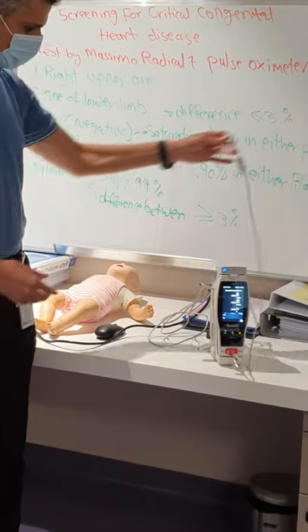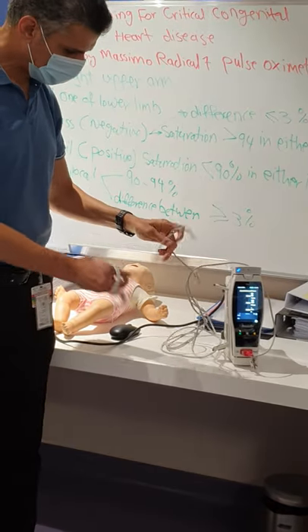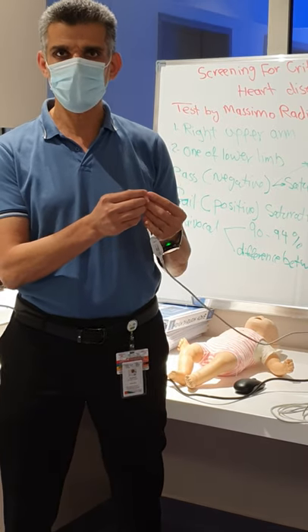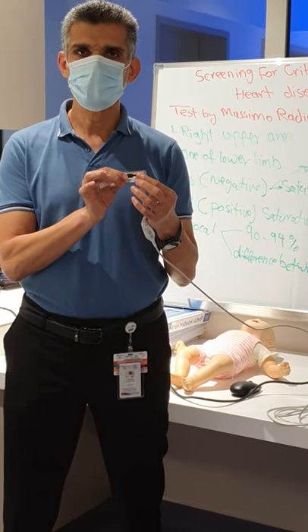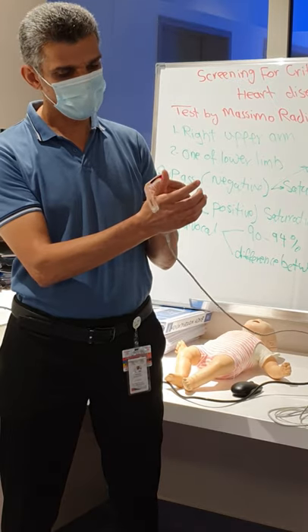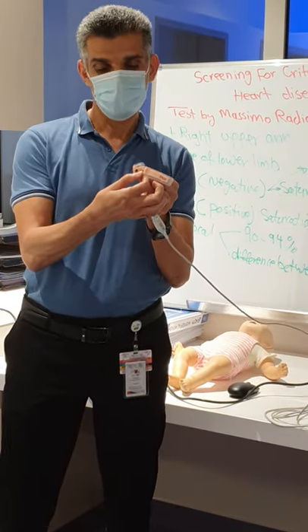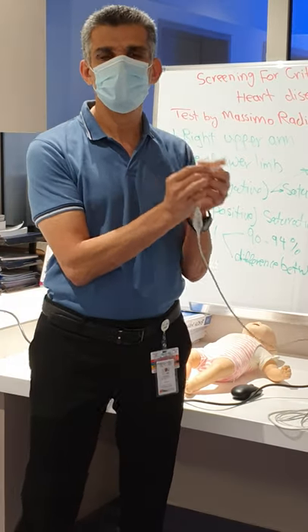You put the Massimo probe with the sensor. The sensor has two parts — you can see. You have to rip off the cover and take it out, and you can see there are two sensors: the sender, the emitter, and the recipient. These have to face each other with the tissue in between. Usually in newborn babies it's the whole arm, but for me it's my finger. The light beam traverses the tissue from the emitter to the recipient to start recording.